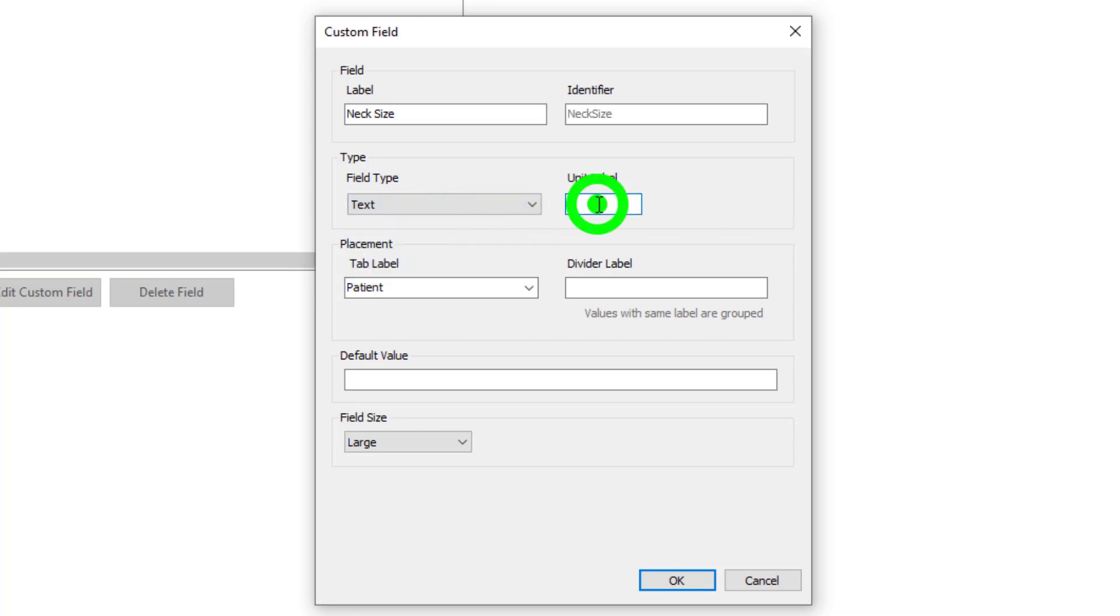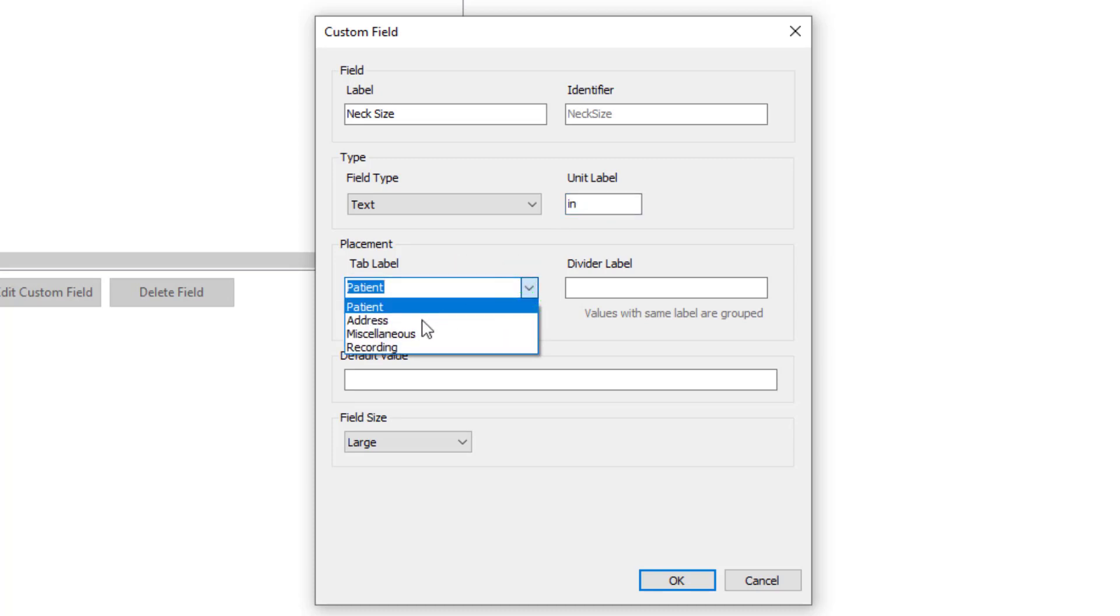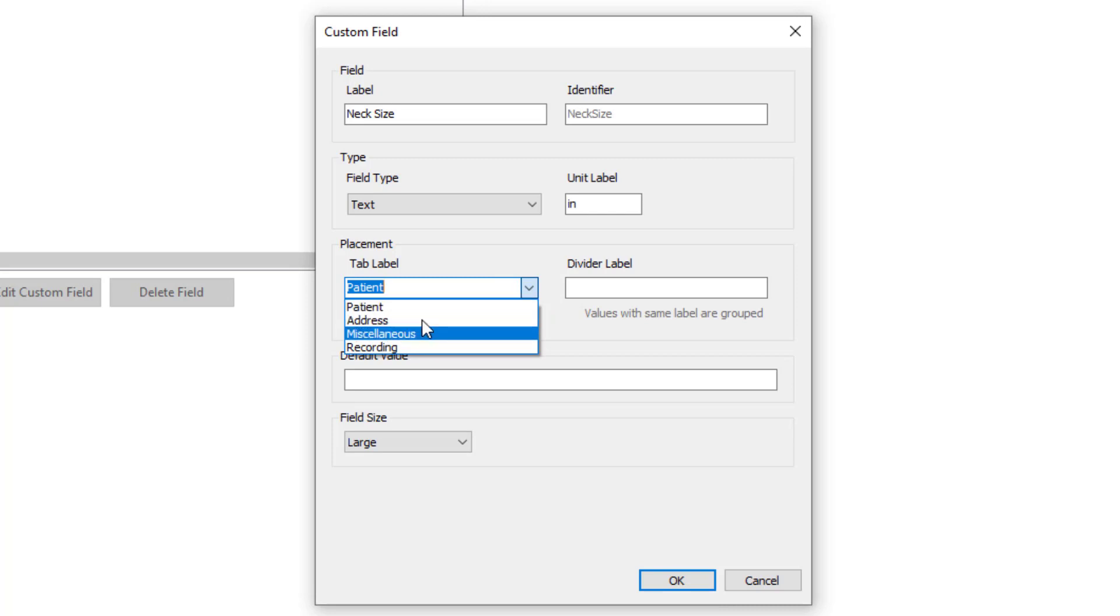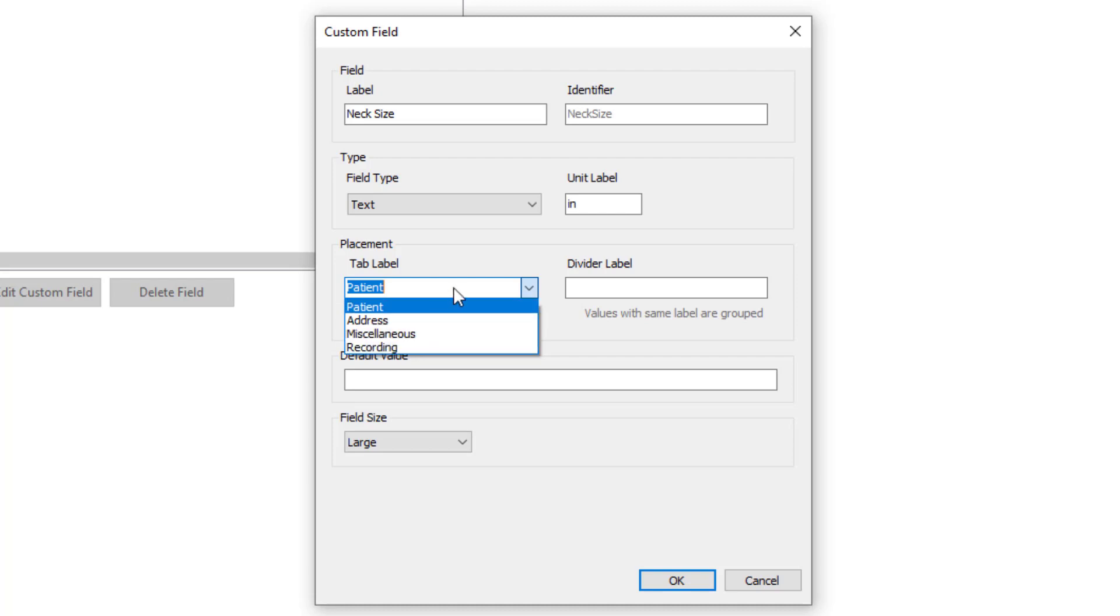We'll set our unit label as inches and we will place it in a tab. So we have the option of patient, address, miscellaneous, or recording. For this one we'll just leave it in the patient.